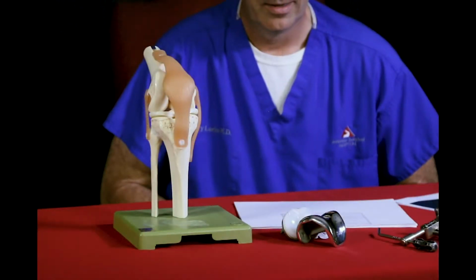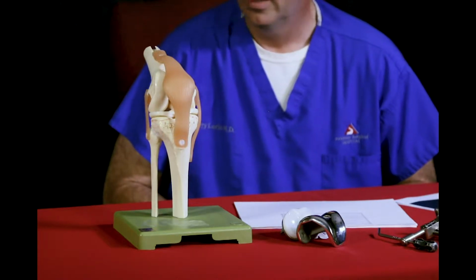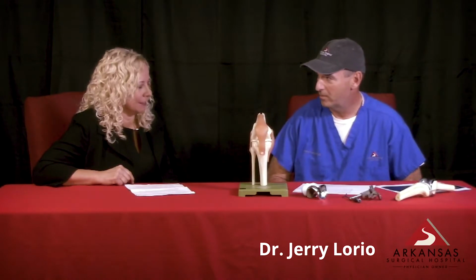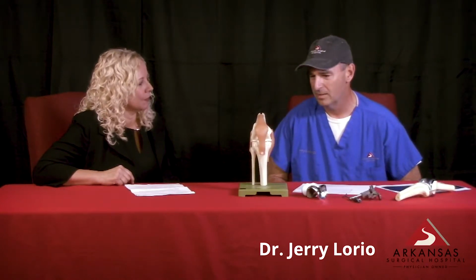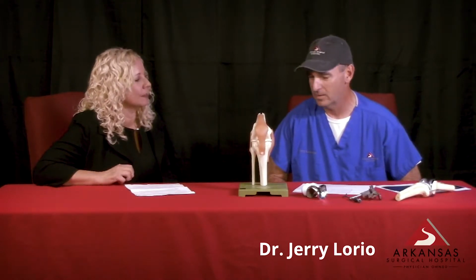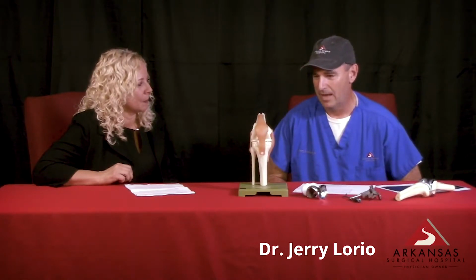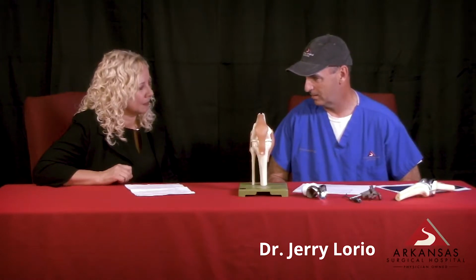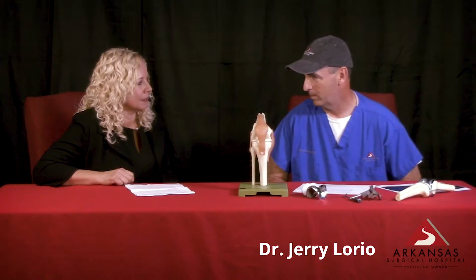Right. So I started making some variable cuts at a time when they were doing knees with CT scans and MRIs, trying to customize it. It taught me that that was okay. And studies showed if you're within 3 degrees of the axis, it's okay. So I stayed within those parameters and now have a technique where I can take advantage of that and customize the implant so at the end of the day, the knee is not wobbly.